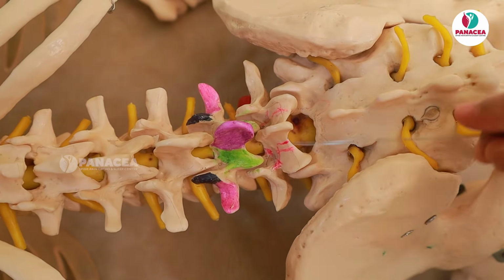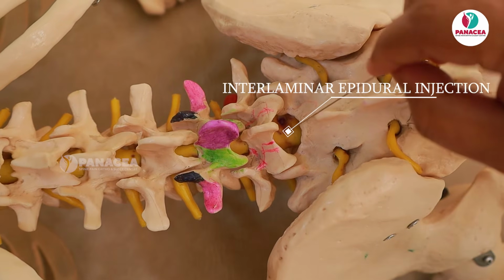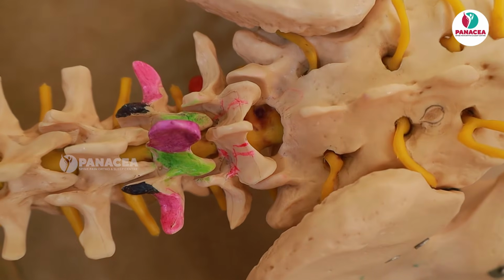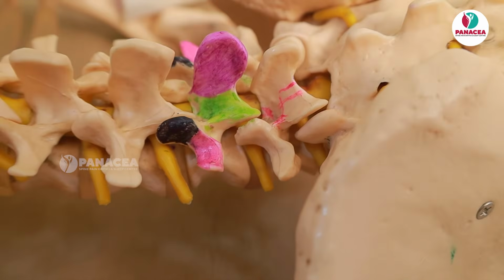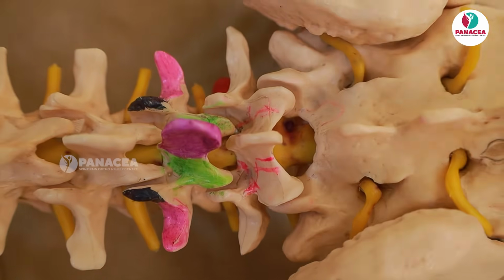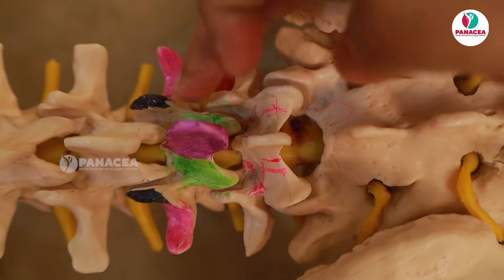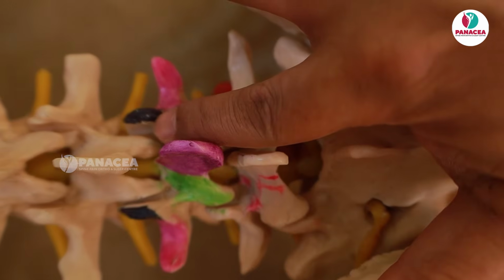See here, this is the interlaminar window. If you go through this, it is called an interlaminar epidural injection, but what I am showing is a transforaminal epidural. So you tilt the C-arm almost 30 degrees oblique. Try to see to what extent you tilt the C-arm. Now this is the AP view. Look at the spinous process. The spinous process is exactly in the center, equidistant. If you measure from pedicle to spinous process, the distance is the same in fluoro.